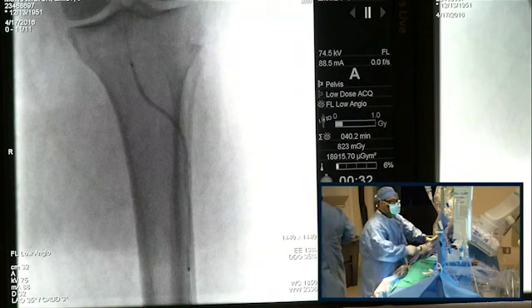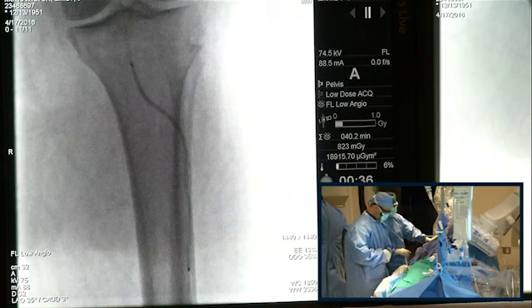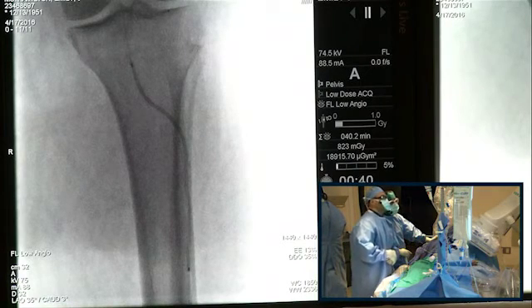Okay, that's enough. You can come down. We are eager to see the angio. It's 2 minutes and 14 seconds left.